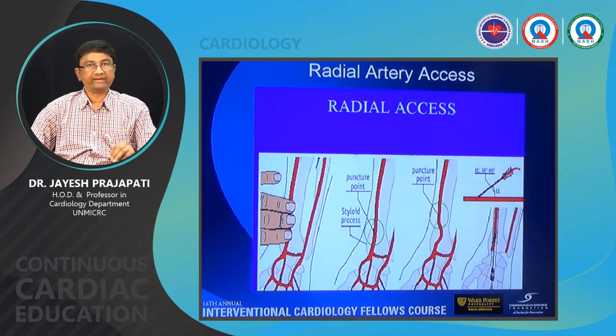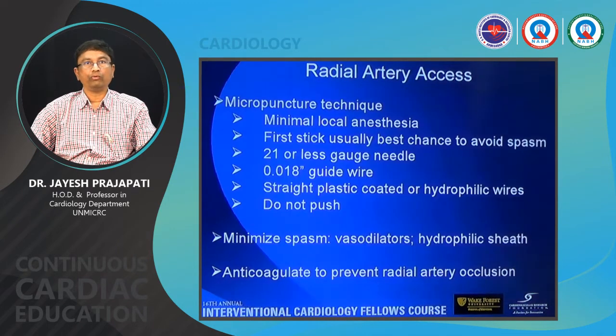With some people, the intracath is a very soft one, so you can push it inside and then introduce a wire. But with a Terumo one, sometimes it goes in intimally. But here also, once the free flow comes, put in the wire, a 018 to 021 straight tip wire, that Terumo one or another one. The wire should go very smoothly. If your wire doesn't go, always take the advantage of fluoro. Do a fluoroscopy and then move ahead.